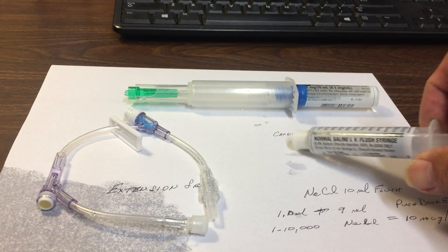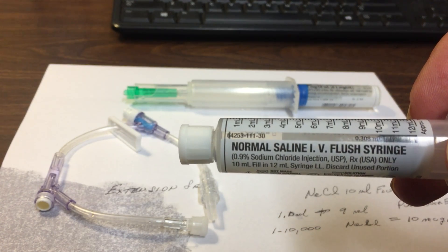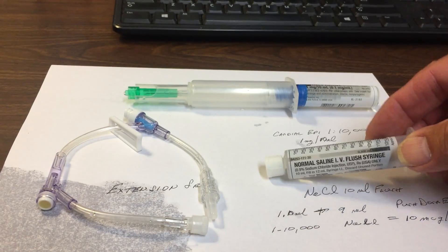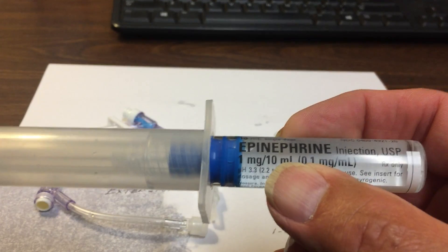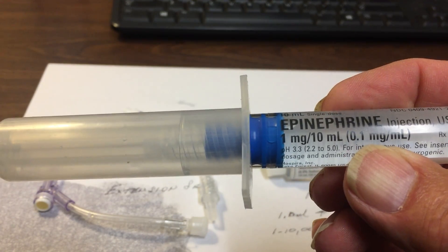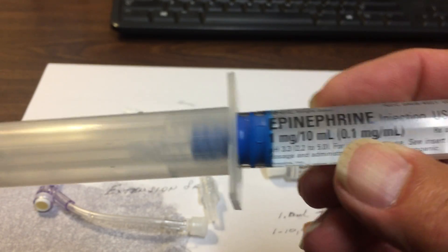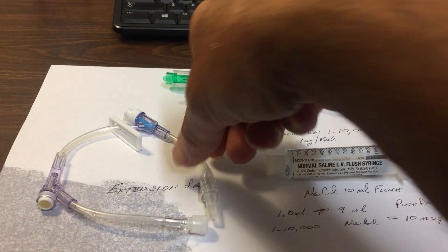What we've got is a 10cc syringe that is full of normal saline — 10cc's in there. We've got an amp of 1 to 10,000, 1 milligram per 10ml, of cardiac epinephrine, and we have an extension set.